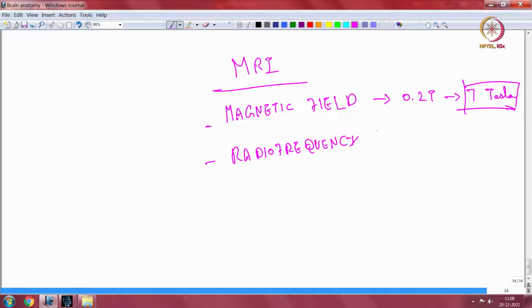So, you can do a lot of stuff with the radio frequency. You can pulse it, you can phase it, and you can vary the duration. So, there are various methodologies adapted to change this radio frequency. Again, I am not an expert in any of this stuff, I am just conveying it, it is interesting to note this stuff. But you need to know these things as basic stuff.